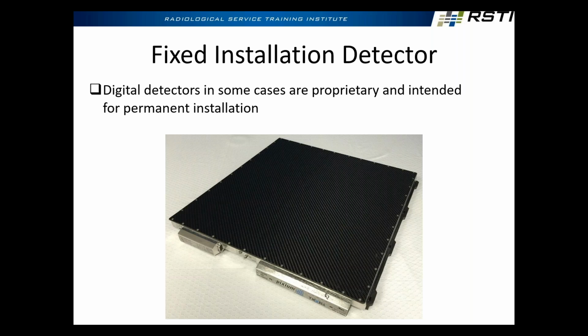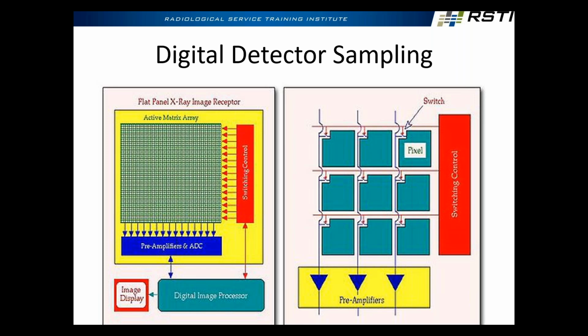But of course, in doing that, we've got things to think about as far as how many pixels we have, our bit depth. This is all stuff that we get very deeply into in phase 1: 8-bit processing, 12-bit processing, 16, 32. What that really controls is how many shades of gray we have available to us. Oh, we're out of time. So last question.